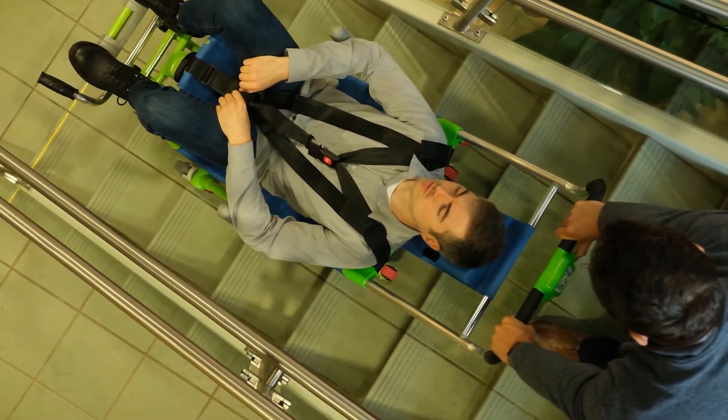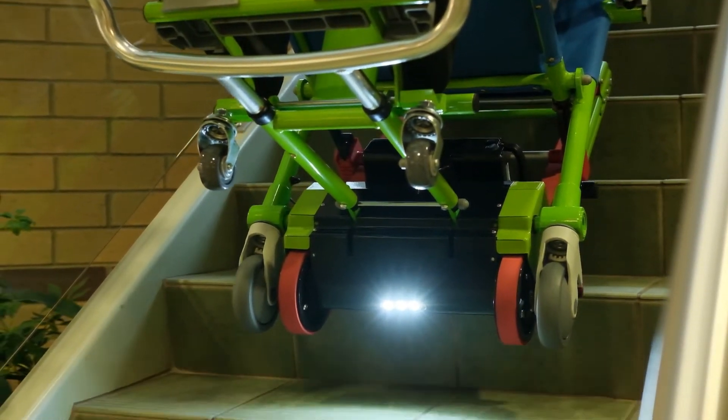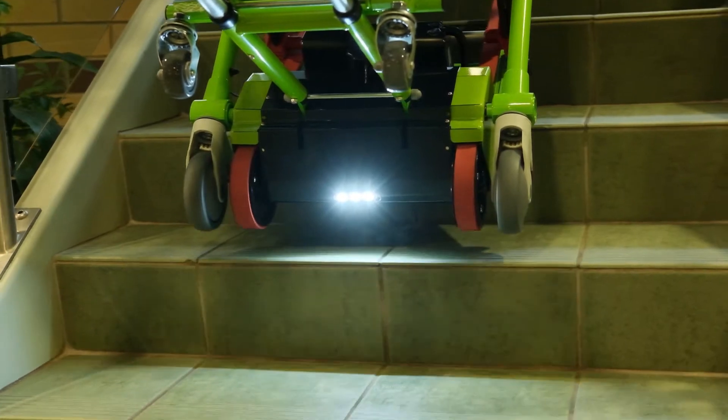Lightweight yet incredibly strong, the chair can accommodate a passenger weighing up to 182 kilograms or 28 and a half stones and climb multiple flights of stairs on a single charge.